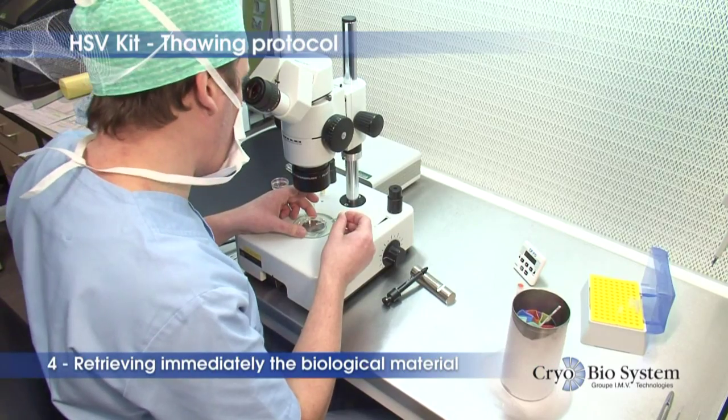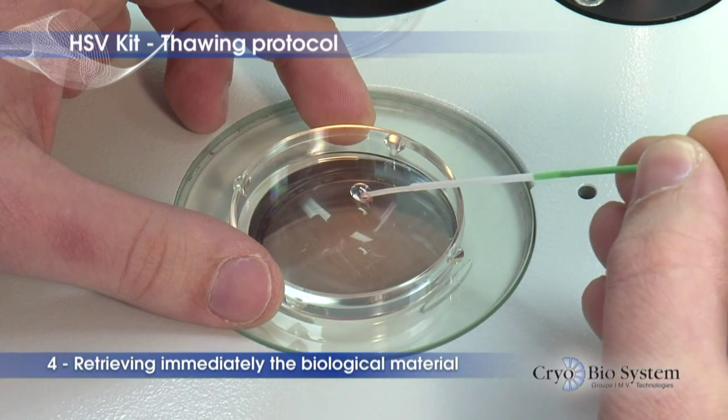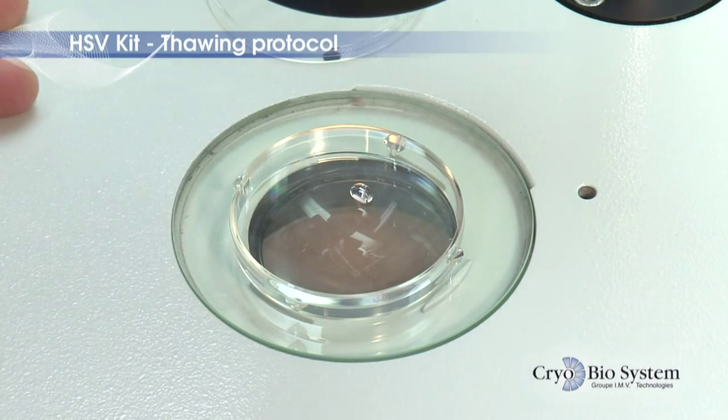Retrieve the biological material by immediately putting the extremity of the gutter in contact with the thawing solution.